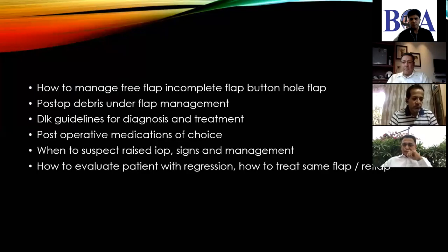So Bajar, are you saying, suppose you have a suction loss and the flap has been created? No, that is a different issue. Okay, you're saying just now, before the start, when Nitin heard the little residual hissing sound, and said, before starting the flap, let me put the thing back on again.